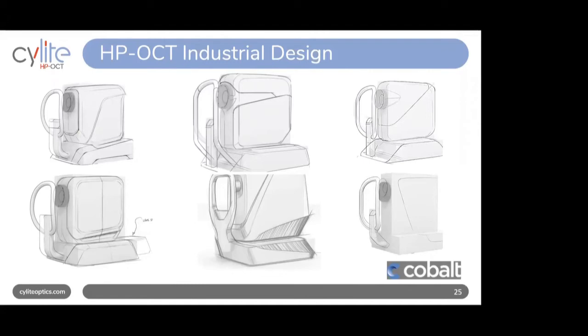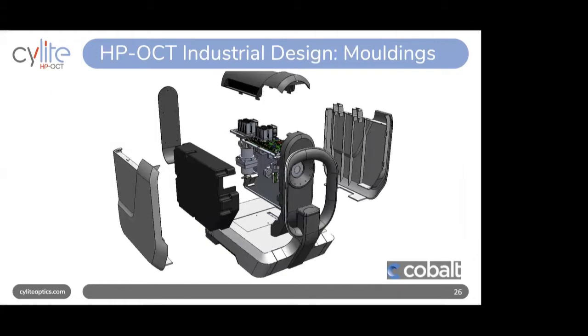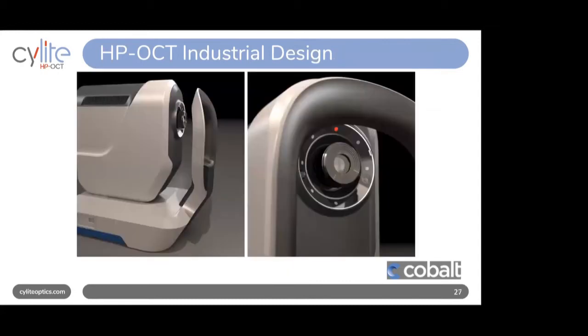And then you come through the design, and then you have to go through the process of actually building all of the parts that go into this, designing the moldings, the plastic moldings that go around there, how it fits together, all the screws, all the clips, colors, a huge amount of mechanical design work, and also patient testing, human factors testing of how this all works from a manufacturing perspective, how it works from a patient perspective, and how it works from a clinician perspective. And you finish up with something that looks like this, which is a beautiful, sleek piece of instrument, which is very different from anybody else's.